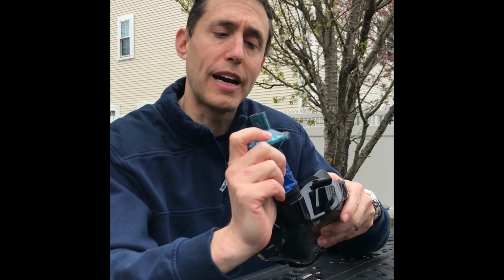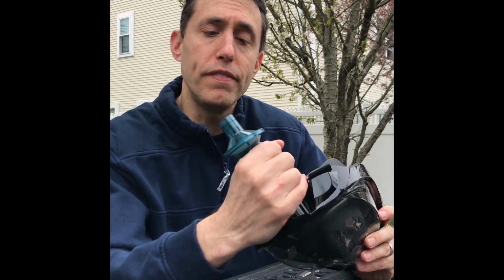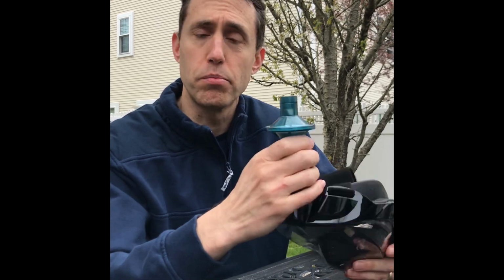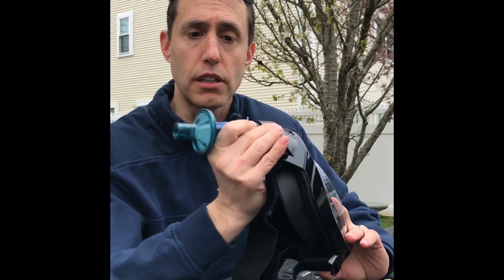Like I mentioned, this is the ViroMax filter. It's rated 99.99 for viruses. There are other filters that are even more efficient, but the question is, is that really necessary? And do certain filters make it harder to breathe through it? So that's another issue that people who are interested could look at.